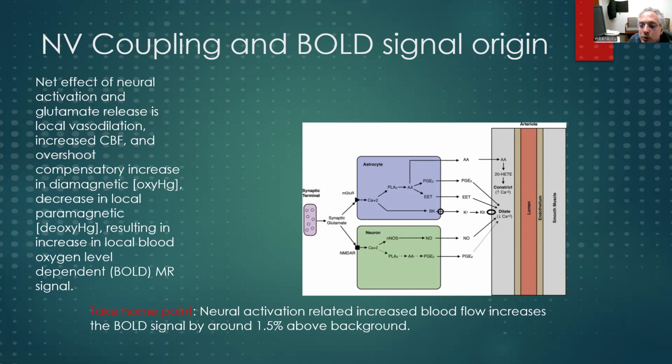And so for most people who are doing direct patch clamping and measuring directly neural tissue activation, this is very indirect. And you might even think, well, what if there's a tumor sitting in all this tissue? Wouldn't it just destroy this complex biochemistry? What's the likelihood that an fMRI should really work in a pathologic setting? What if there's a bunch of edema and the nitric oxide can't diffuse through all the extra fluid?